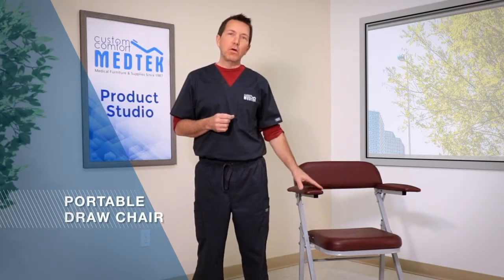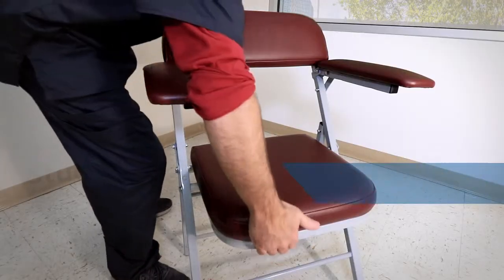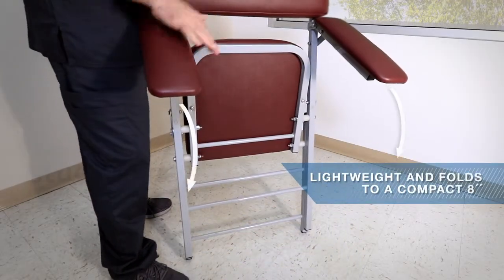Phlebotomists who work in tight spaces or need portability love Custom Comfort's portable draw chair. The chair is strong and sturdy but also lightweight and folds to a compact 8 inches. The frame is made from reinforced steel and is powder coated for easy cleanup. The seat back and arms are padded with high-density foam and upholstered with medical grade vinyl.